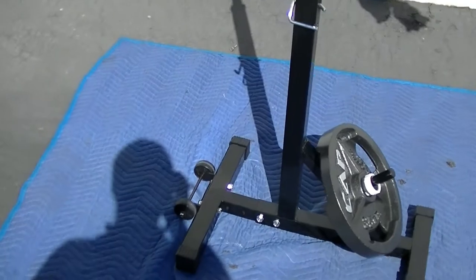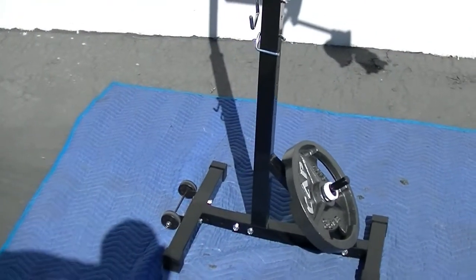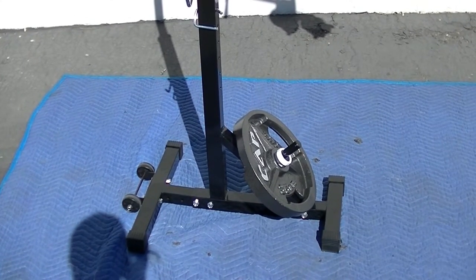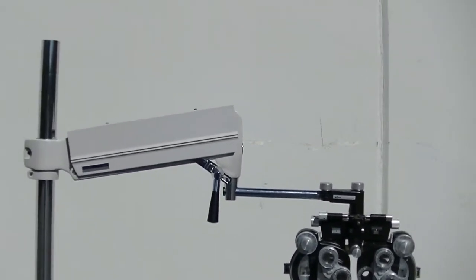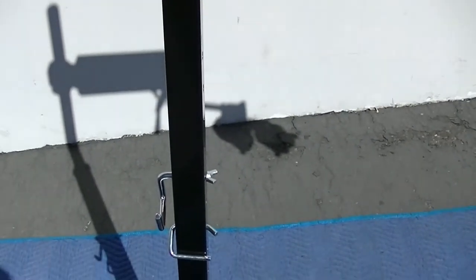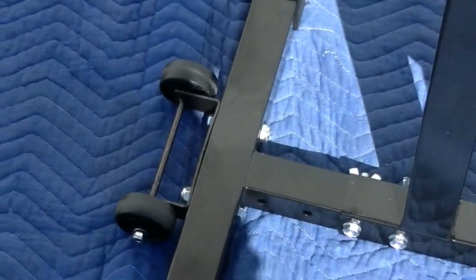Basically that's all it is. The wheels make it really nice because if you take the phoropter off the arm, you can roll the whole thing — the phoropter arm, the pole, and the weight — right to anywhere you need. So the components are: the Reliance phoropter arm, the pole that goes inside the 2x2 metal casing, the retaining pin that holds the pole into the support, the safety pin, the wheels, and the weight that provides all the stability.